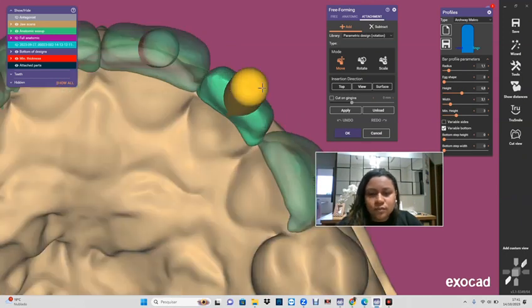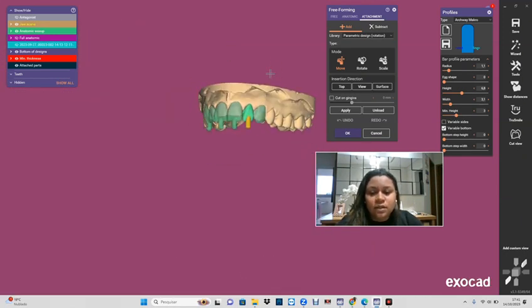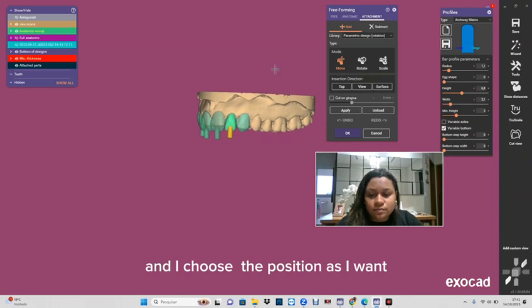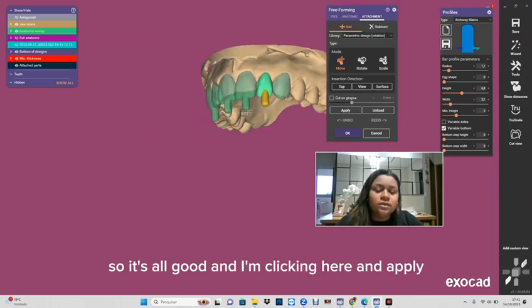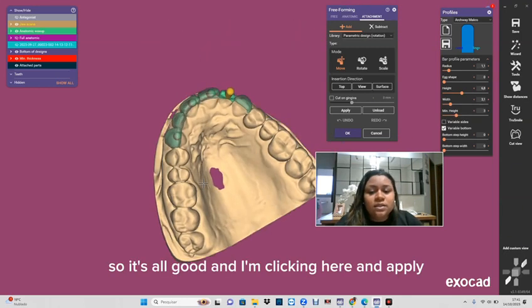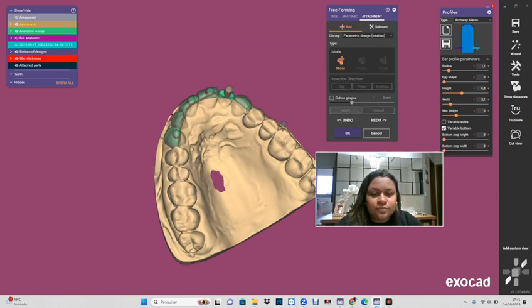So here I'm showing the position as I want. So it looks good and I'm clicking here and apply.